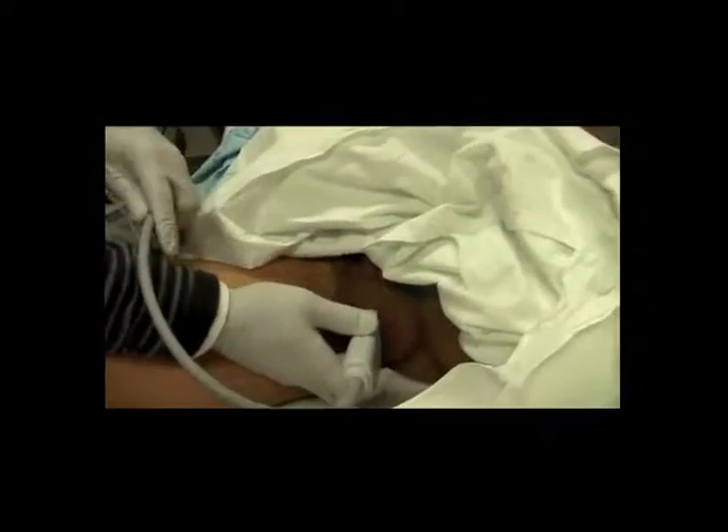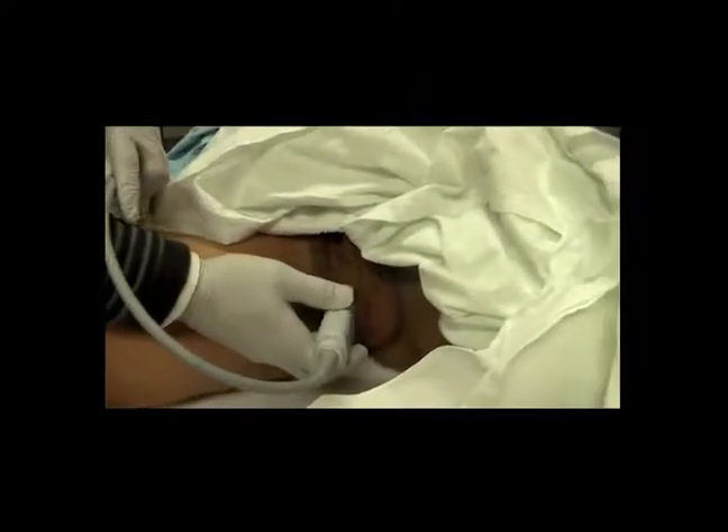One important part of doing this scan is proper patient positioning. The patient is laying supine and they're going to be in the frog-leg position. Unlike other scans, what you want to do is get a roll of towels underneath the testicles to support them up and provide some support — that will also relieve any discomfort. You can also use a different towel to pull the penis back so it's not directly in your field of vision. The first thing you want to do, with the indicator up towards the patient's head, is do a long axis or sagittal view of the testicle, and you'll fan through that testicle accordingly.